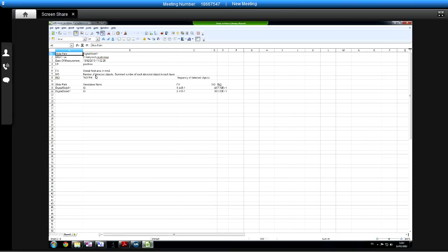So you see here, and we just need to, again, I think in proper Excel, I think it formats this properly, but so this will be -1, so this will be a field area of 0.54 millimeters squared, I think. We can check this. In fact, it'll tell us in here, won't it?